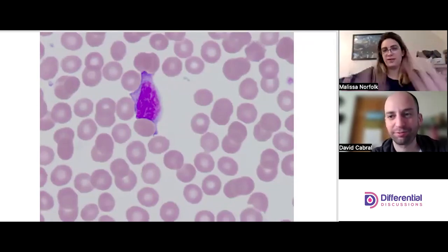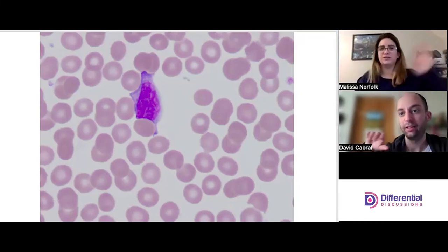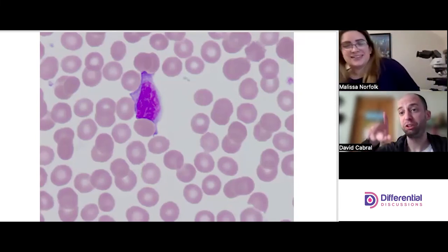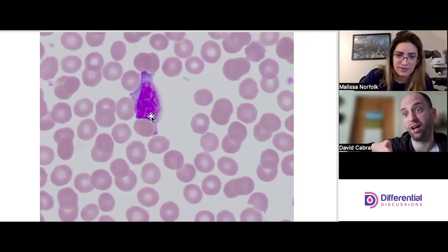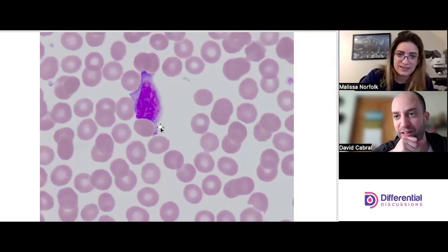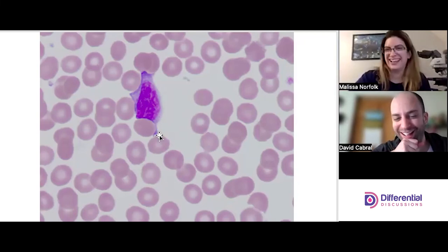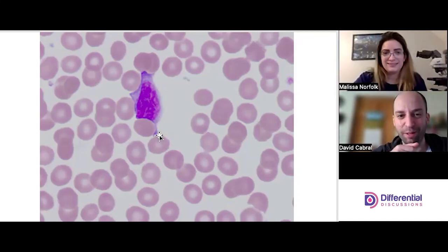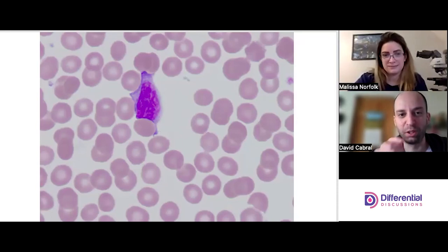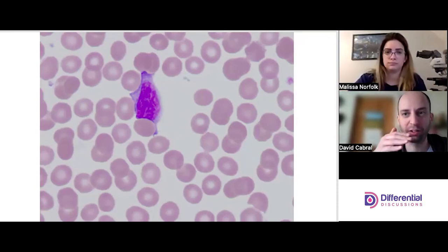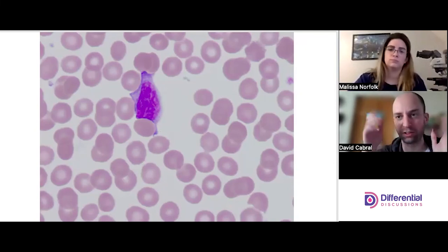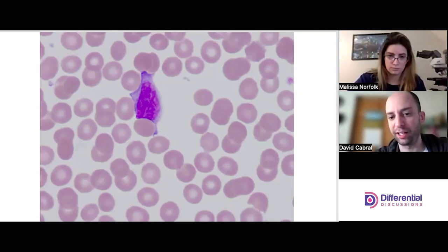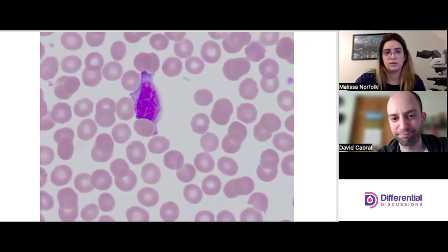This is one of my favorite pictures — this one and the first reactive we saw. Talk about stretchy: this cell is coming down and around that red cell on the bottom. It's literally grabbing. Very grabby, great blue, the full spectrum of blue radiating out from the edge, and the nucleus is very very stretched. This cell checks all the boxes for reactive lymph.